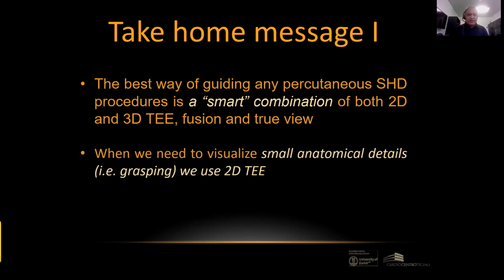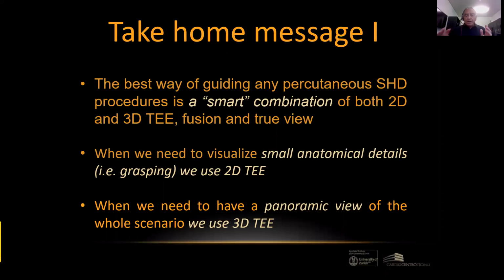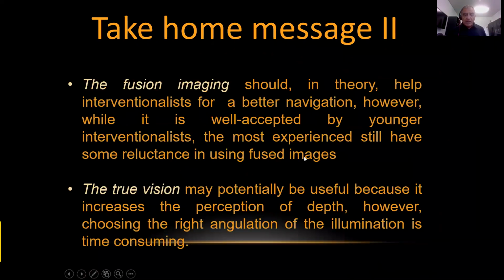But generally speaking, when you need to visualize small anatomical details, for example grasping, you can use 2D TEE. When we need a panoramic view of what's going on, where is the catheter, where is the septum, where is the mitral valve, then we can use 3D TEE. The fusion images should, at least in theory, help interventionists with better navigation, because they show the soft tissue and the position of fluoroscopic images. However, in my experience, this is well accepted by younger interventionists, but the most experienced still have some reluctance in using fused images. Most of the time they go back to 2D or go back to 3D.